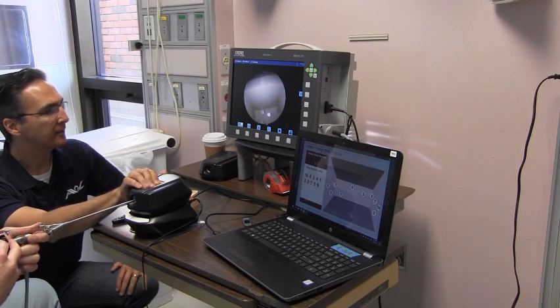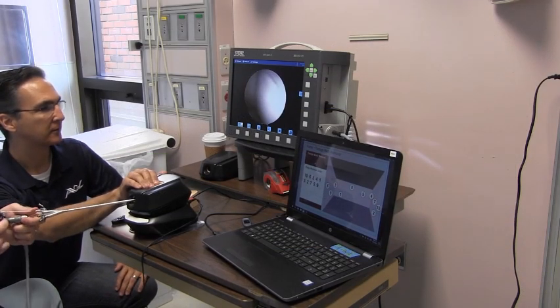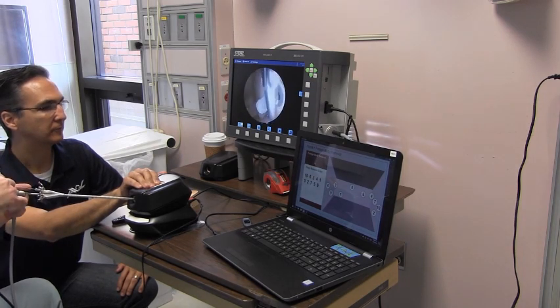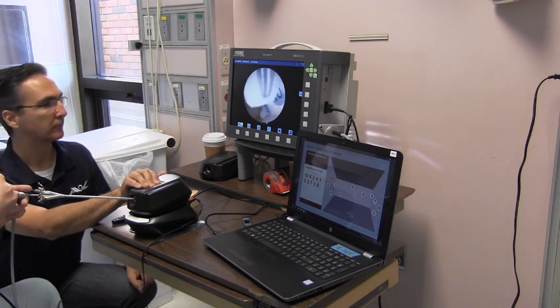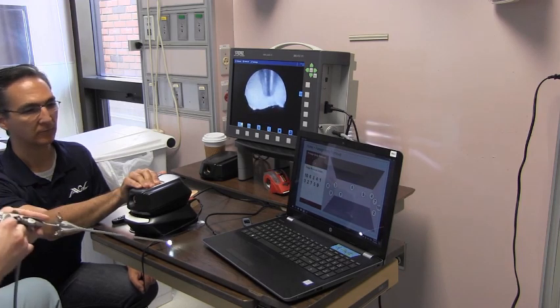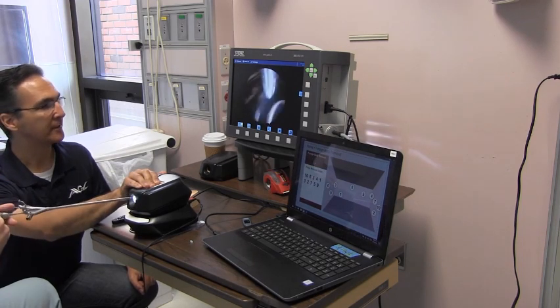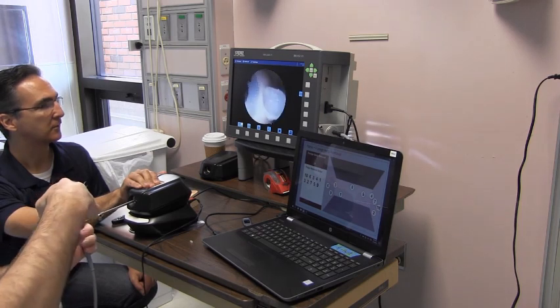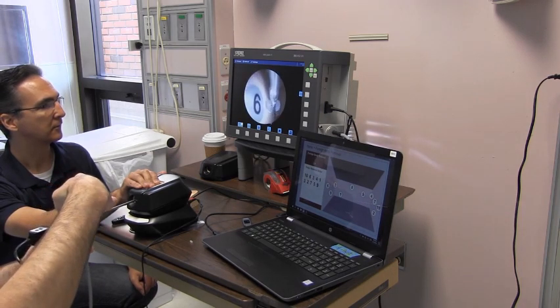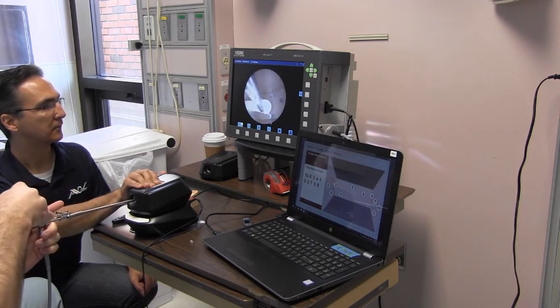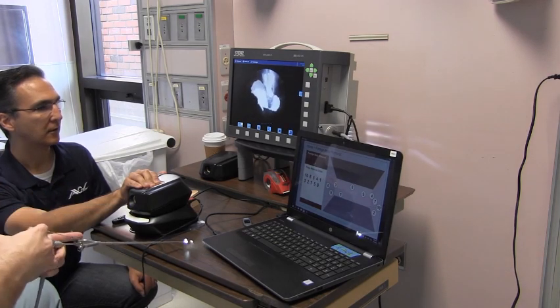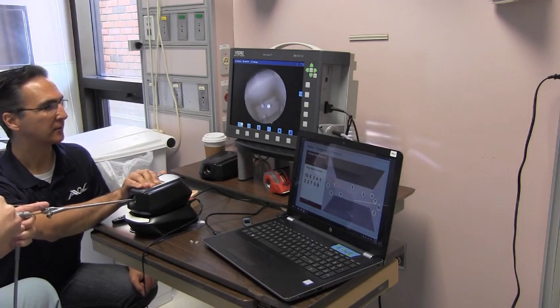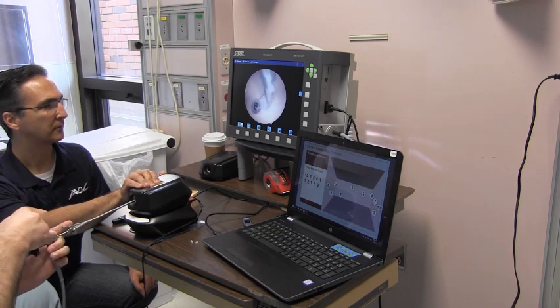Begin by introducing the hysteroscope into the Emig simulator. Move the hysteroscope to each polyp as the target number is called out by your proctor. Make sure to use the displayed navigation map to move efficiently from polyp to polyp. At each target, grasp the polyp with the biopsy forceps and remove the polyp from the wall of the simulator. While leaving the polyp and the jaws of the forceps extended from the scope, withdraw the scope and place the polyp in the external collection cup.